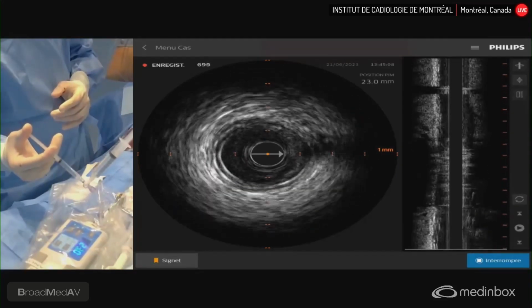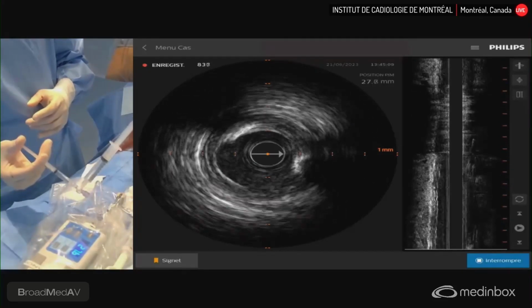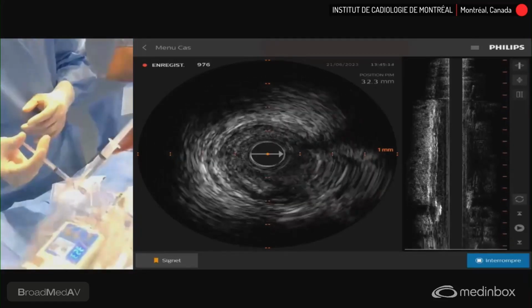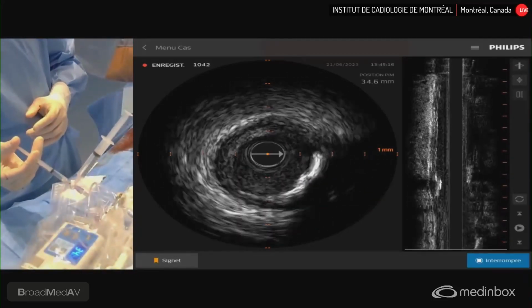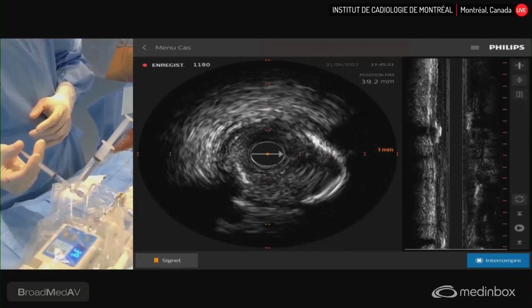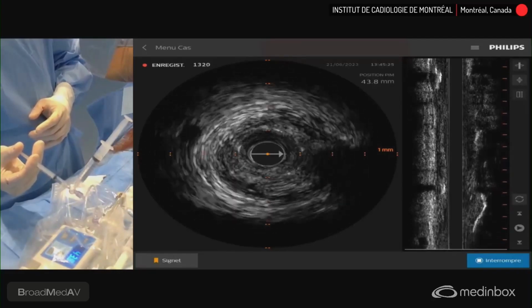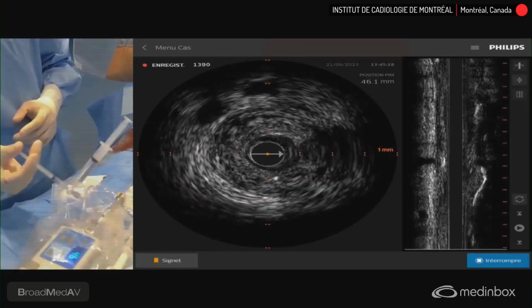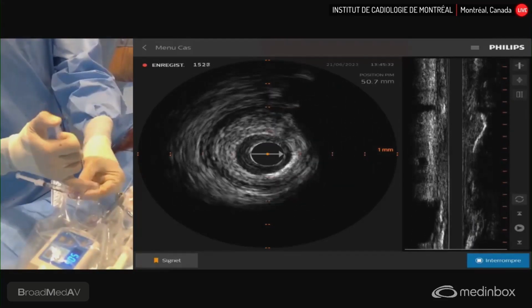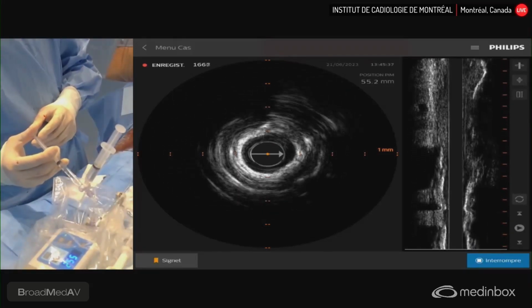Now we see plaque throughout the vessel, not very severe. Another branch. And we see a calcification, which is kind of spotty at this time. We are probably close to the lesion initially. So we see calcium, but it's a little bit superficial. It's always been less than 90 degrees. The occlusion is here, calcium now, but it doesn't seem to be extremely dense.